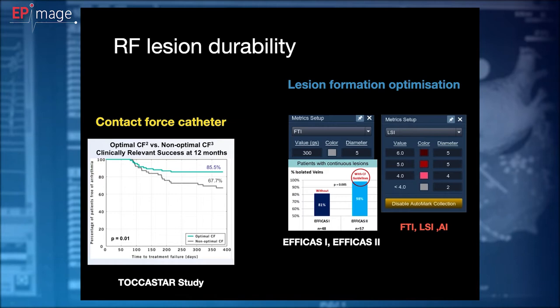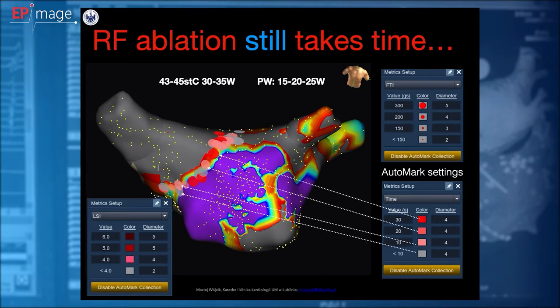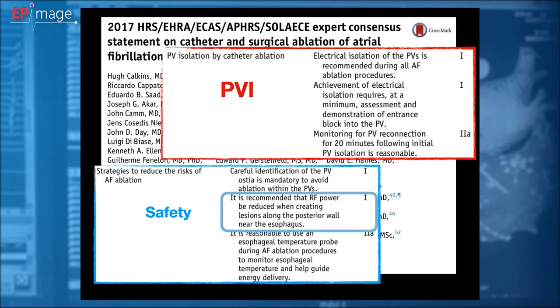Additional aspect is ablation based on lesion size index or ablation index, which further improved our effectiveness with ablation. We know that LSI and ablation index are better predictors of lesion dimensions than power, impedance drop, or FTI. But still, radiofrequency ablation of atrial fibrillation takes time. The expert consensus statement on catheter surgical ablation of atrial fibrillation says that it is recommended to reduce radiofrequency power when creating lesion along the posterior wall near the esophagus.